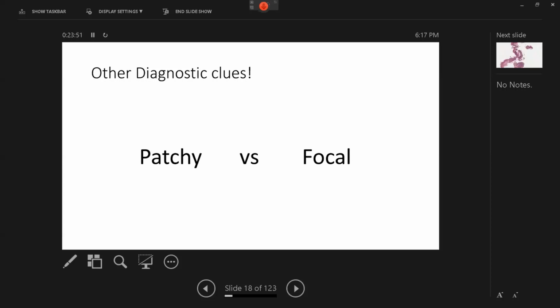You need to know when you will use that terminology in your report. Because it is like in renal pathology, when you use the word focal or diffuse, or when you use segmental and focal, they have completely different meanings. And here as well, in the biopsy world of GI pathology, they have a completely different meaning.